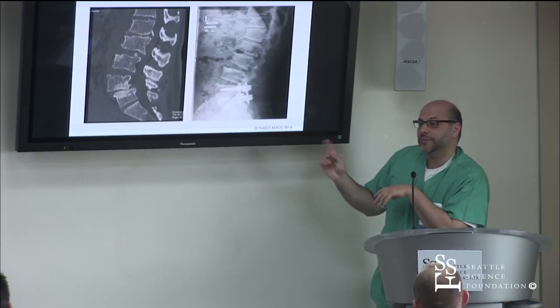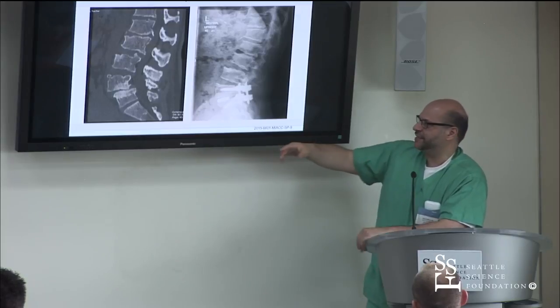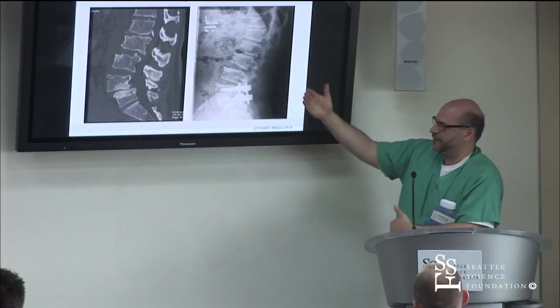Yeah, I'll start with the blunts. I'll just start with the blunts. And if it's really easy, like somebody who has a big disc, if I was doing this level, I'd probably just start with the cutting right away. I wouldn't even start with the blunts. I'd just start with the cutting because there's plenty of space.